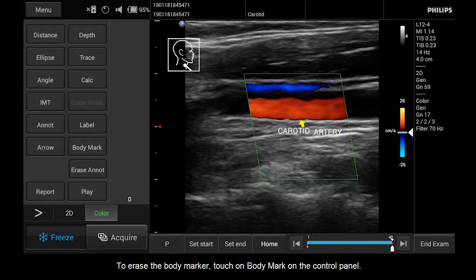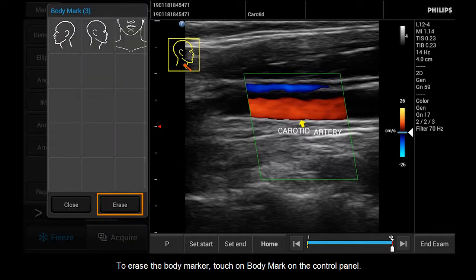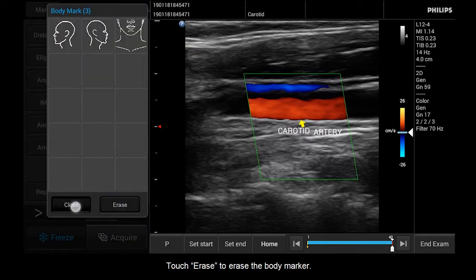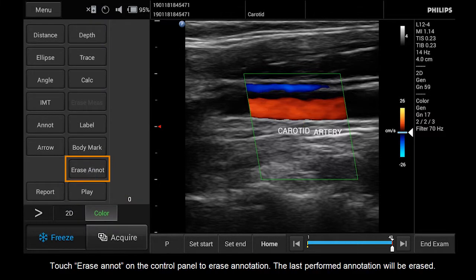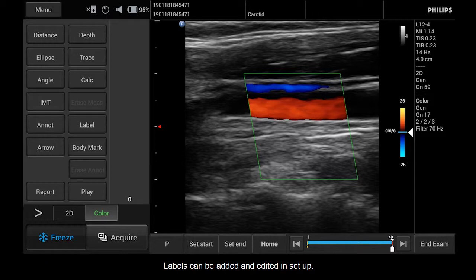To erase the body marker, touch Body Mark on the control panel, then touch Erase to erase the body marker. Touch Erase ANNOT on the control panel to erase an annotation. The last performed annotation will be erased. Labels can be added and edited in Setup.